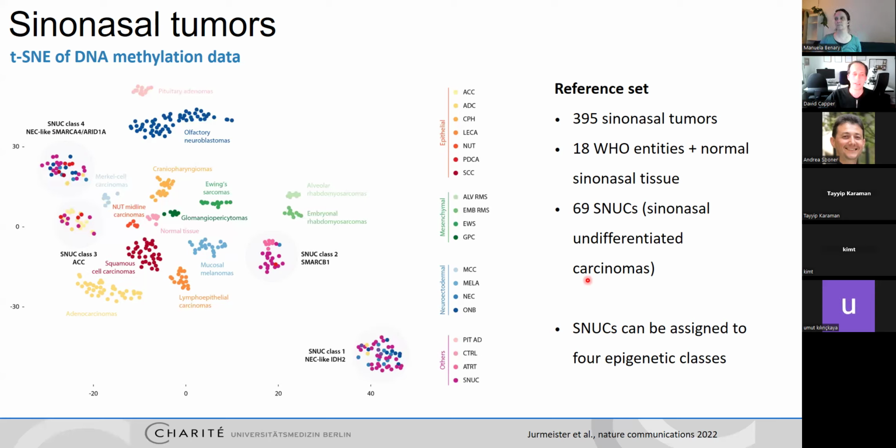At the moment, what is used for most of these classifiers is just a selection for the probes with the highest variance amongst these groups. And this filtering step of looking at the highest variance of these different groups will usually give us already a focus on the CpGs that are likely the most distinct among these classes. So there is a selection, but what we don't do at the moment is deconvolute and try to extract inflammatory cells or mesenchymal cells or these kinds of things.